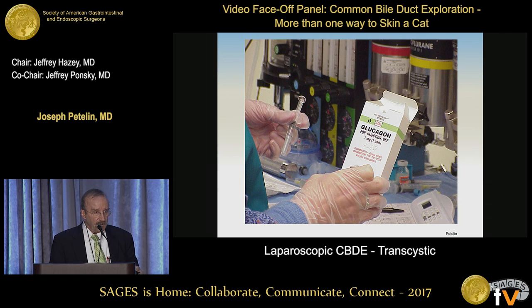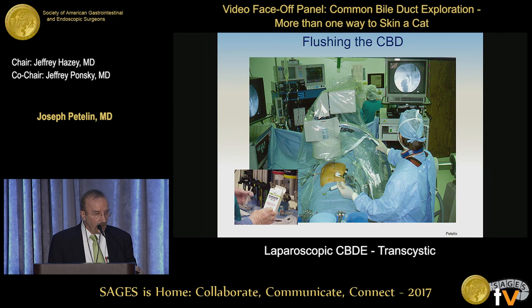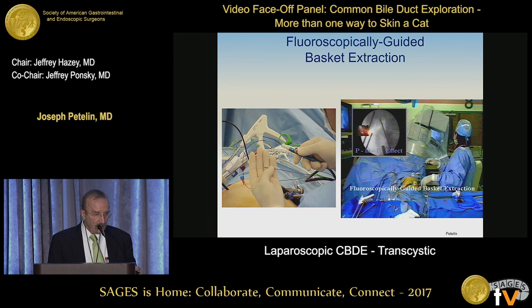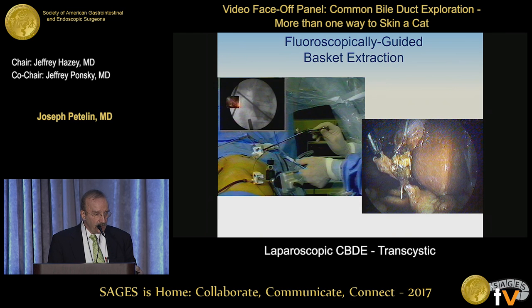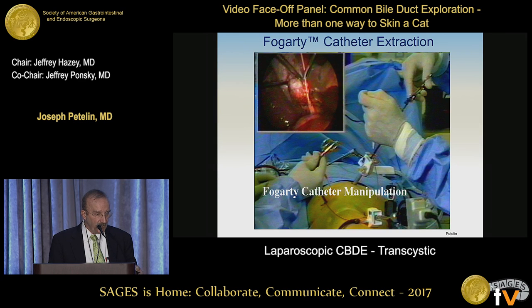The glucagon, again, as soon as the anesthetist is infusing it, you need to be ready to shoot the cholangiogram. And then flush it, and sometimes you'll get small stones out. But stones larger than 3 millimeters, I don't think, are going to flush through the ampulla. So that's, again, how we do that. Again, those are things from the video.